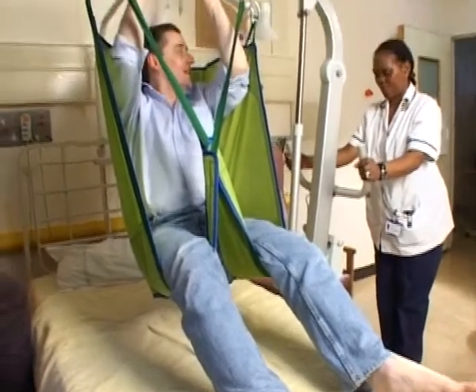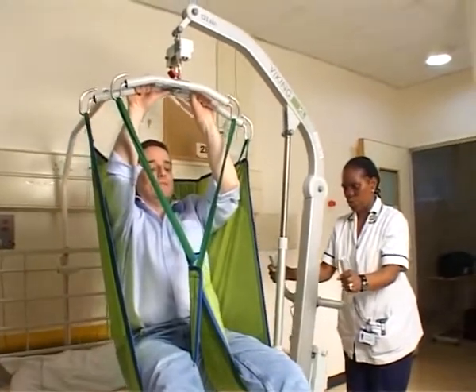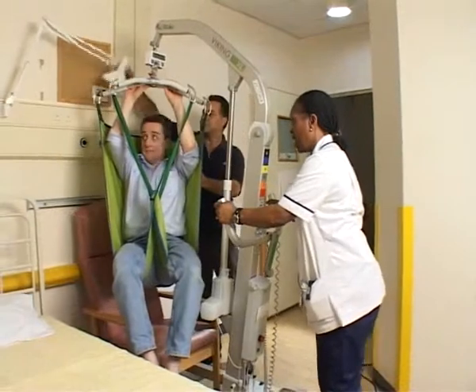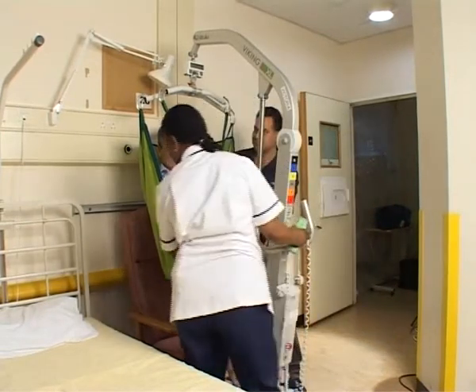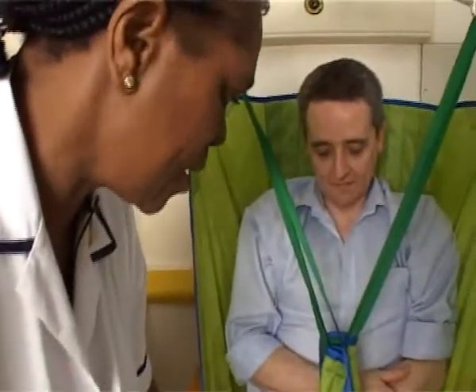You alright, Ed? I'm fine, thank you. I'm just going to move you towards me. At the back, I'll just bring back the legs again. And we're ready to go down. Nice and slowly.